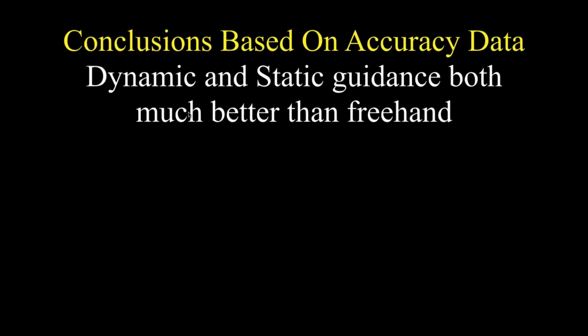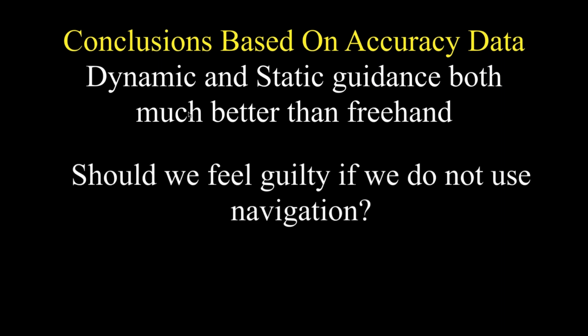So I would just challenge you who's listening to say that if dynamic and static guides, which is the ones with the metal sleeves, are both better than freehand, well, should we feel guilty if we don't use navigation? Or should you always use navigation? I think you should. I think you're going to find that it's just like the old Panorex and the cone beam. A long time ago, we had a Panorex, we were using it. Then everyone went to cone beams.